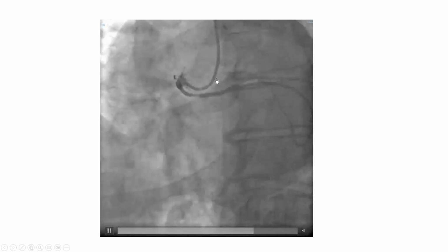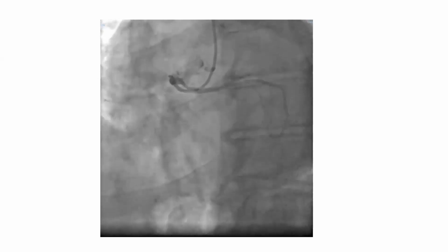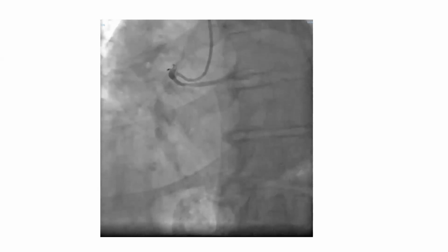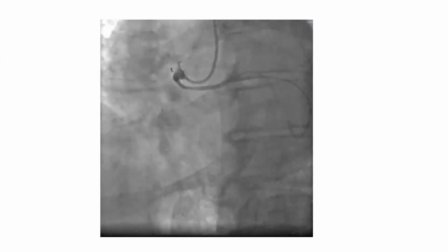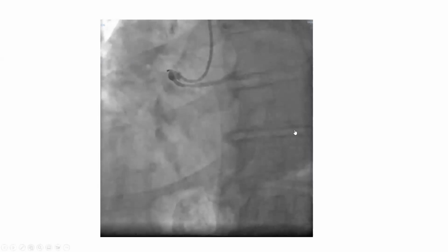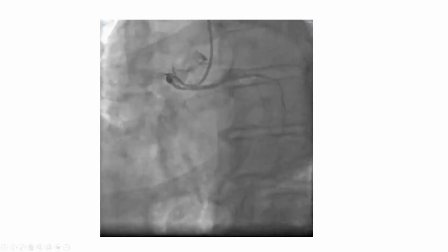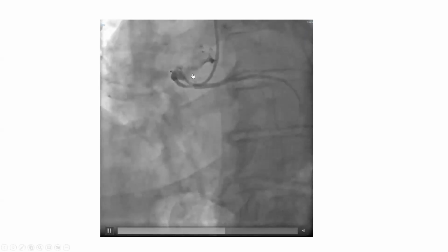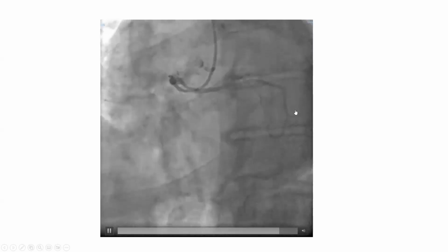So typically in this patient, if it's not coming from the left cusp, it's coming from the right cusp. It could be either from the RCA itself, close to the ostium of the RCA, or it could be a separate ostium, usually very close to the RCA ostium. A lot of time, as you're injecting the RCA, you may see a blush into the left circumflex. So here, anyway, we engage it. It's coming from the right cusp, and this is a circumflex.